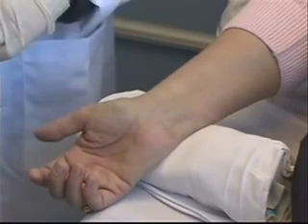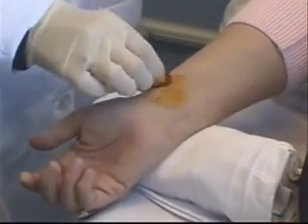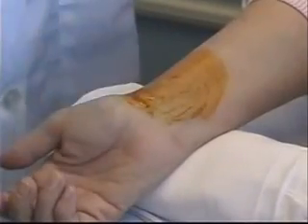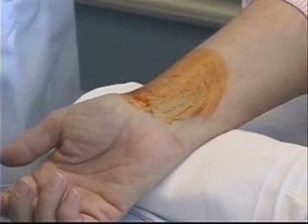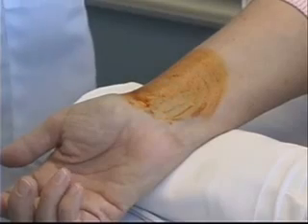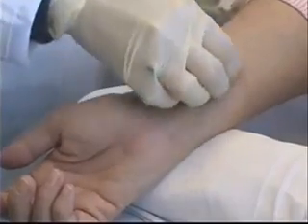The first thing I need to do is clean the area. I'll start with the povidone-iodine, beginning in the middle and cleaning in a circular motion. After I've allowed that time to dry, my next step is to wipe away the povidone-iodine with an alcohol swab.